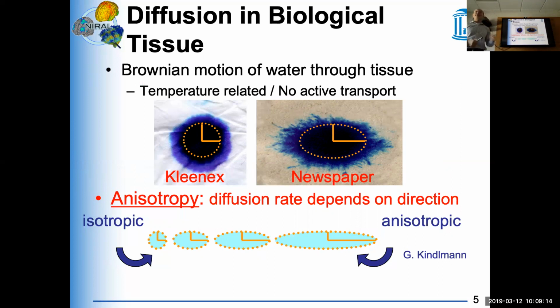Also, a side note, we're not going to talk more about that: you can actually use diffusion imaging to look at the temperature of a body. So temperature imaging in MRI can in part use diffusion imaging. What we're looking at here, though, is more how the diffusion is shaped, to say whether it's anisotropic or more isotropic.